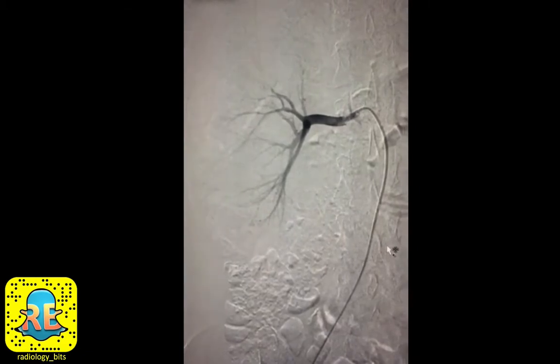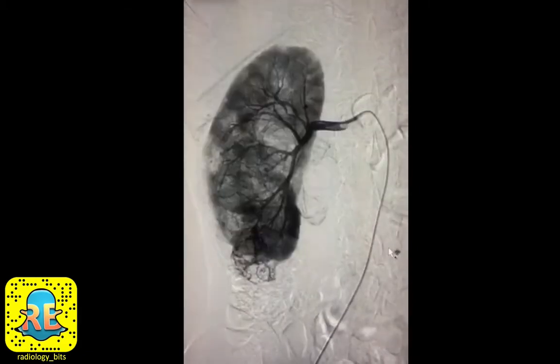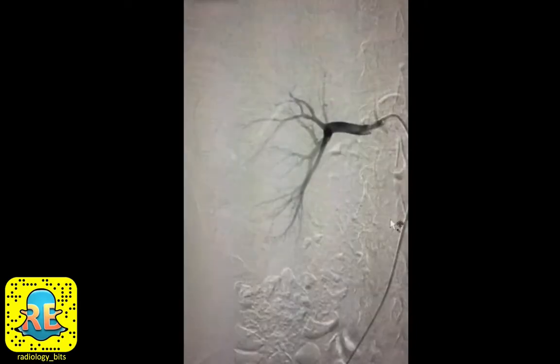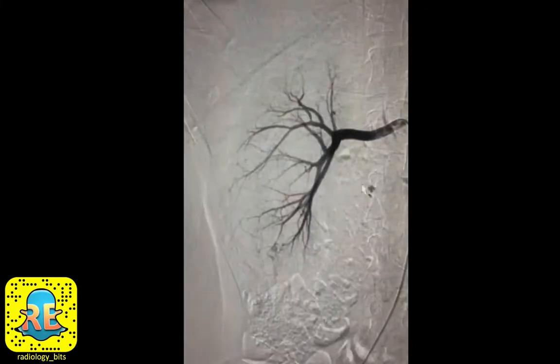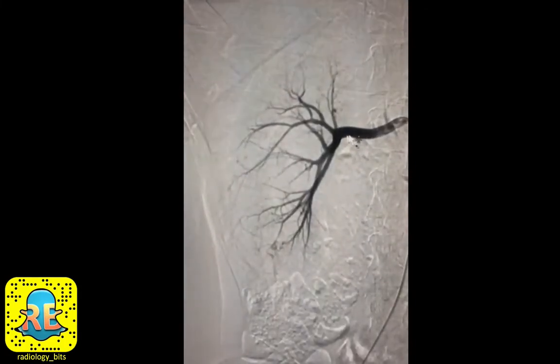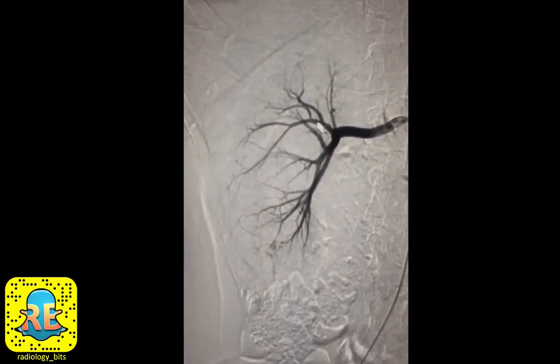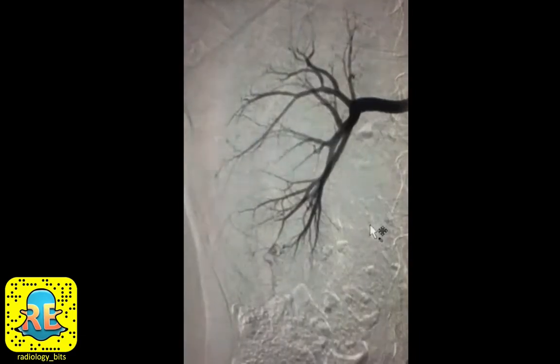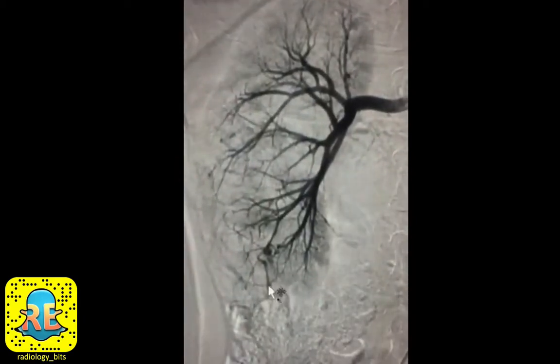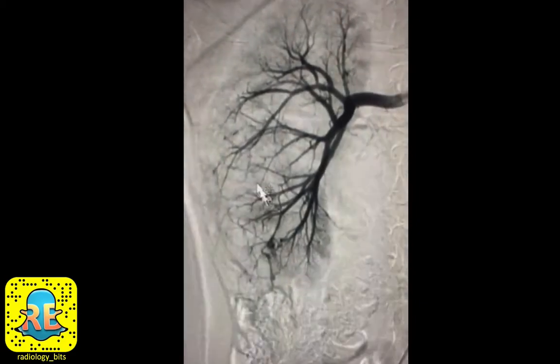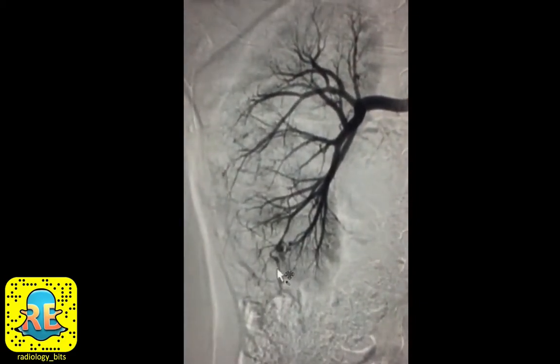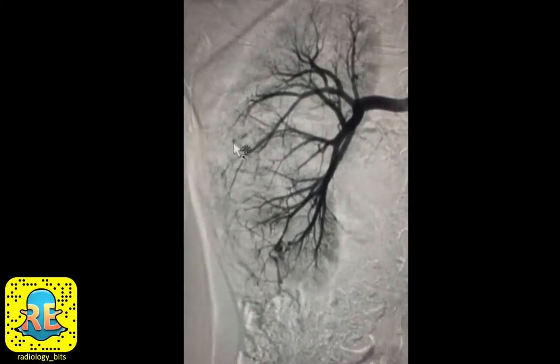With the catheter in the right renal artery, we'll inject contrast. Initially as we inject, you see normal branching renal arterial divisions, but if we proceed further, you'll notice that some of the renal arteries have these beaded nodular areas, which we could call at this phase tiny aneurysms or pseudo-aneurysms.